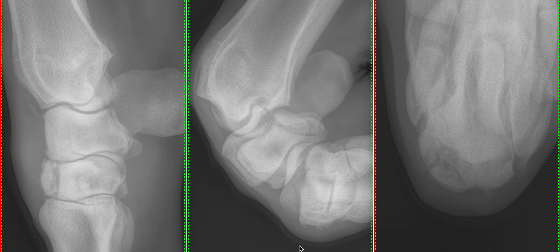So we've got a slab fracture. We suspect the slab fracture is slightly chronic, which fits with the four-week history, and we've also got quite a lot of periarticular new bone formation.